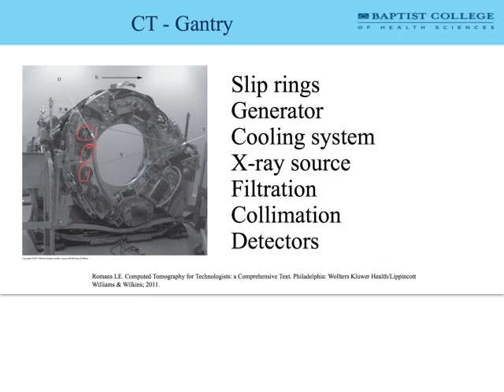So as the scanner is spinning around and around this basketball shape, if we increase filtration out on the edges and decrease filtration towards the center and make this little funny bow tie shape, we will be able to account for these different densities around this basketball-shaped head. Okay? So that's why we use that type of filter.